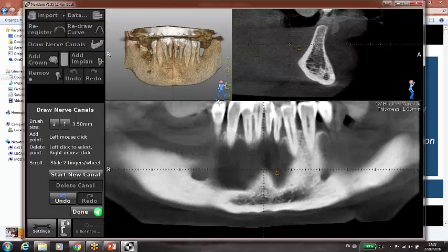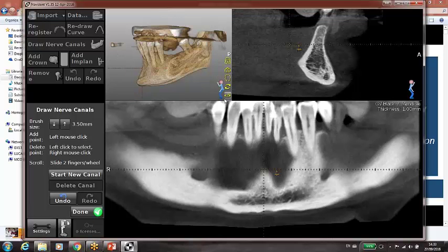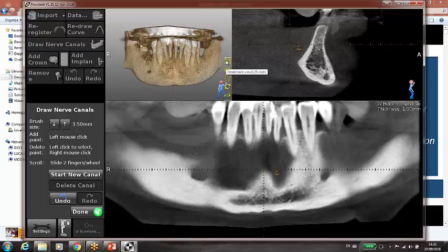And you see here on the right the same icons that we saw before. You can have a picture from beneath, you can have a picture from one side, you can move it on fixed angles, you see? Or you can just click it on front. So there are shortcuts to get you wherever you want in terms of a 3D picture.